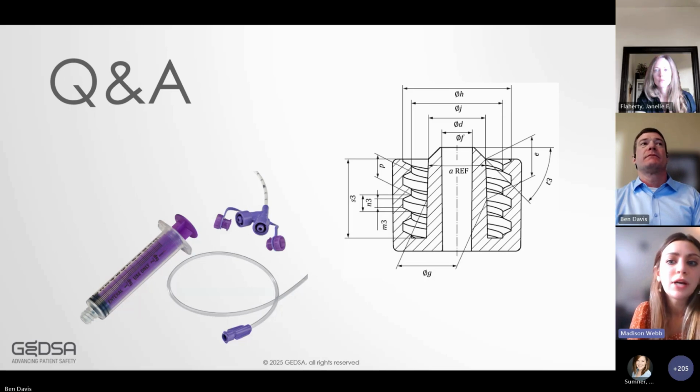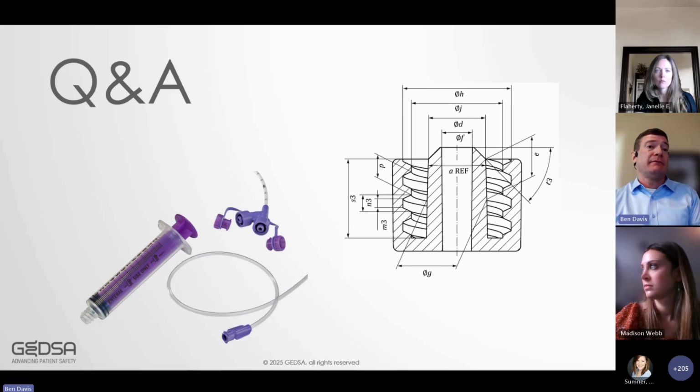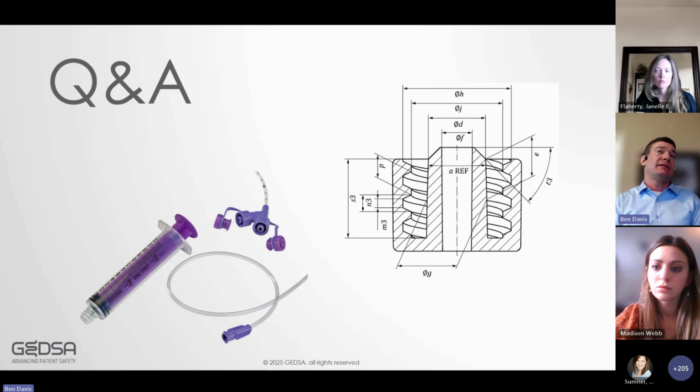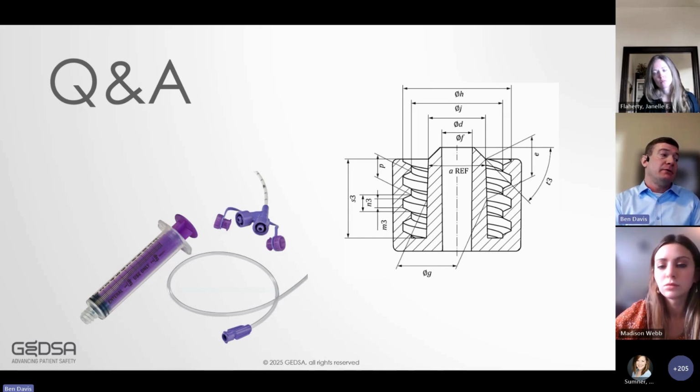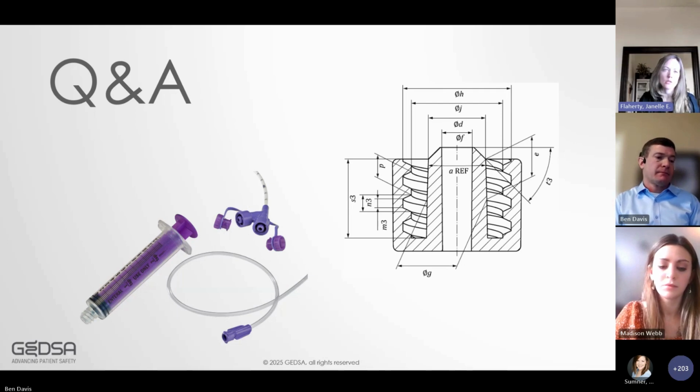Somebody asked which manufacturer has the OTC syringe. Is it Avanos? I am aware of their having an OTC one, and I recently learned that Vesco also now has an OTC designation. I don't know much about that one because I think it's fairly recent, but those are the two I'm aware of. There could be others. I'll just add that not all the products are OTC. There are certain products in their line that they've gotten the OTC designation for, but it's not across the board for everything they offer. Yeah, that's a good point.